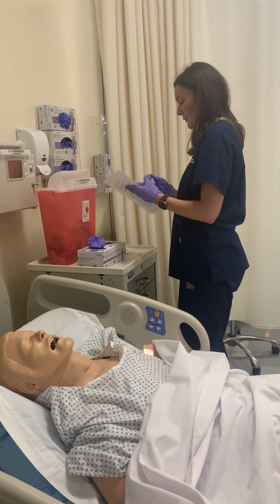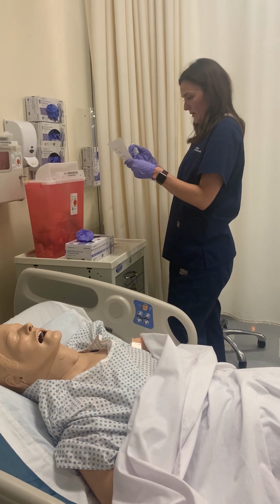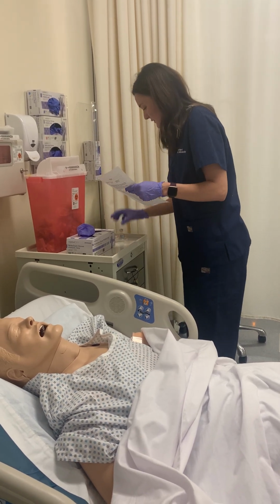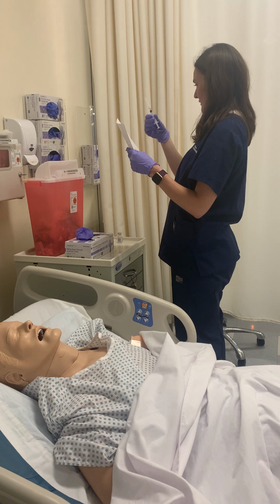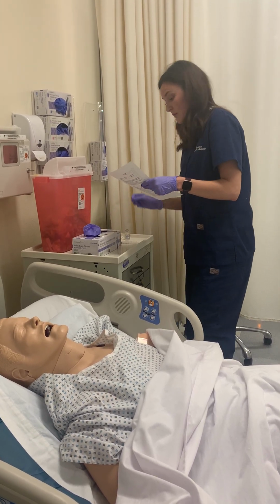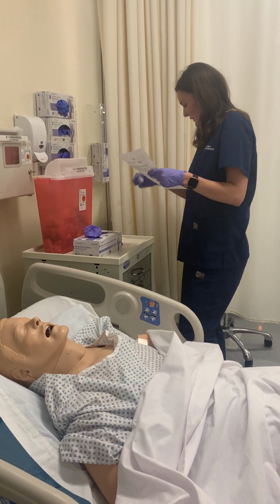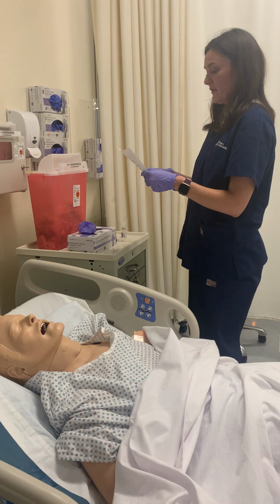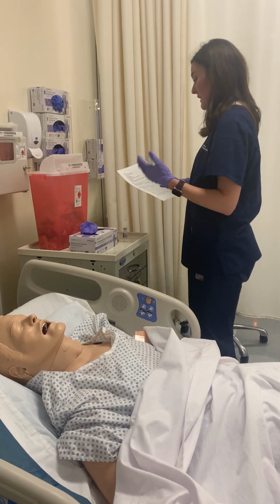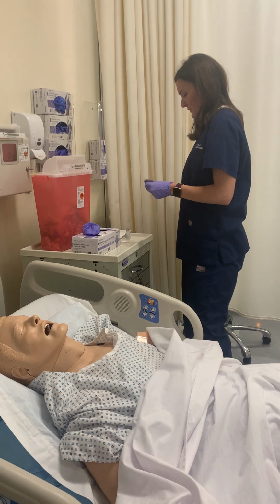And the medication that we are doing is Fluzone influenza, yes, we're doing 0.5 mils, very nice. The time is now. The route we're doing is intramuscularly. Looking at this to make sure it's intramuscularly, nice. And this is because we are preventing complications of influenza. She has an increased risk because of her age. Okay, we've done our third check.